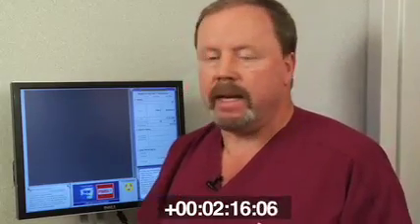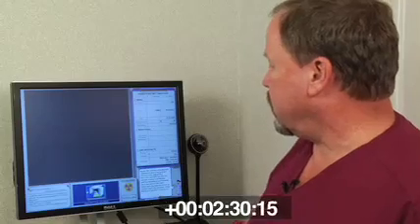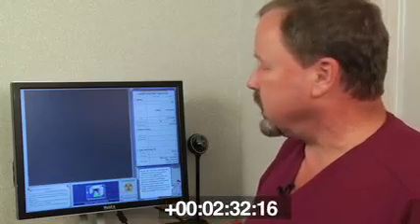And on our patient, we'll get him over here in a minute, and we'll put a lead shield. We use a front and back lead shield. Scatter's not real high, but within the ionizing radiation, it makes sense to keep it to a minimum dose on any patient you have. So right now it's done with the calibration, and it's asking us to seat the patient.